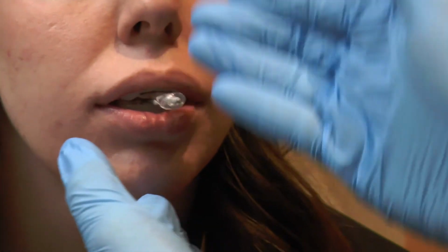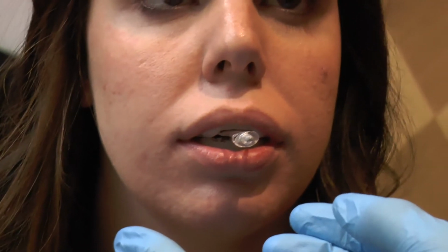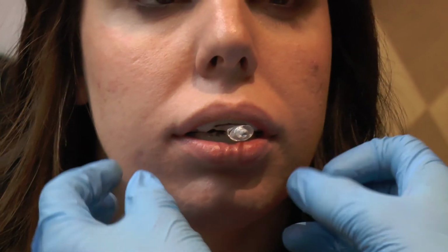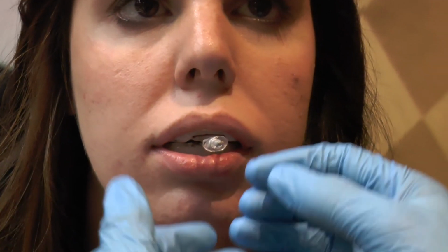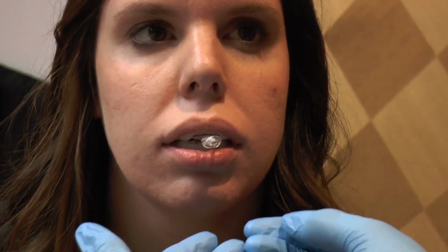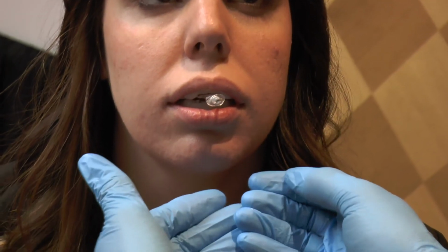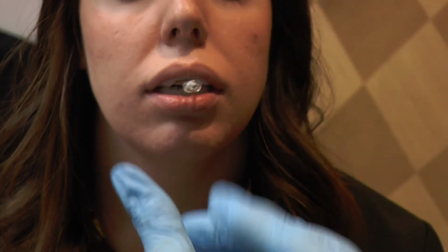If you do not use the nose as a point of reference, what you might find happen is when you assemble the device and they engage the lower teeth, there'll be a tendency of the lower jaw being pulled in one specific direction. Now, if you run into that problem, just remove the tray that's affected, whether it be the upper tray or the lower tray, place it back in warm water, remold it by aligning it with your point of reference, and then reassemble the device.